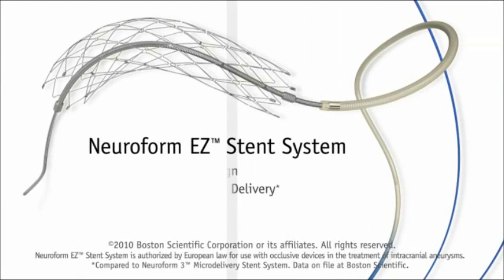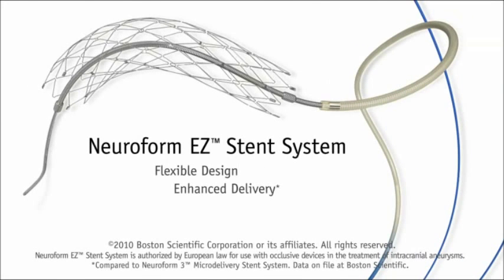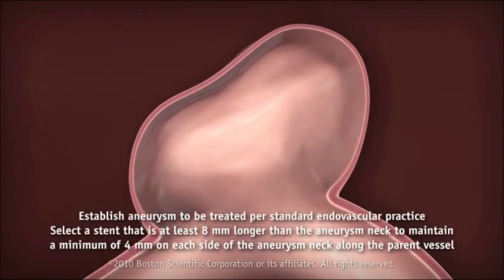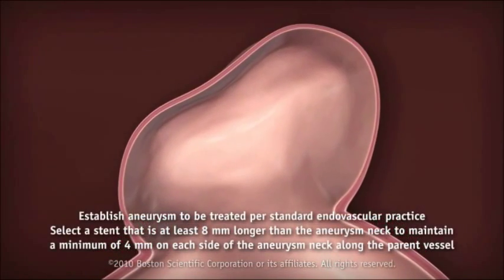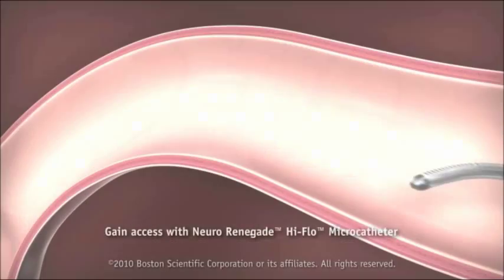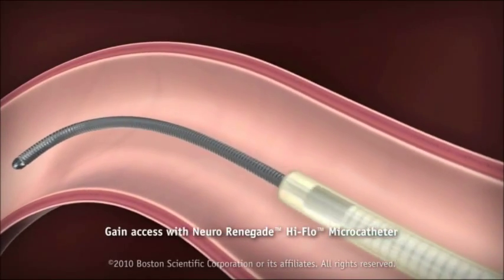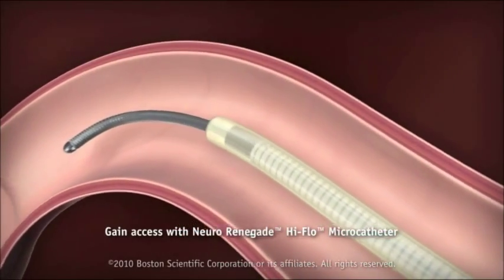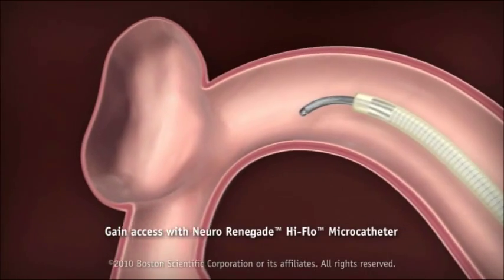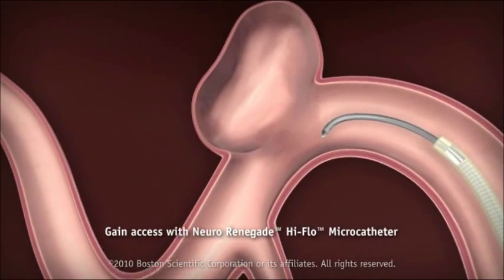Neuroform EZ stent system procedural video. Establish aneurysm to be treated. Using standard endovascular practice, gain access with an access length guide wire and a NeuroRenegade high flow microcatheter.